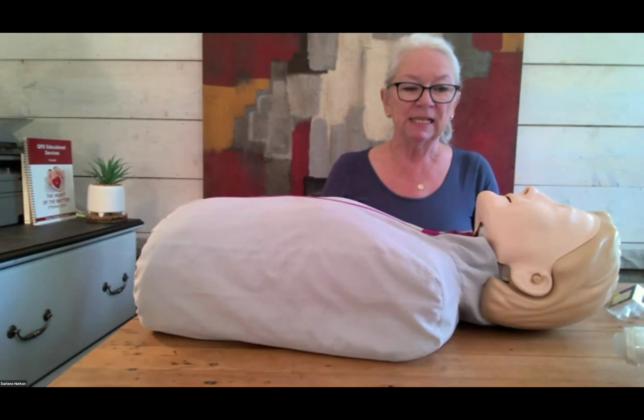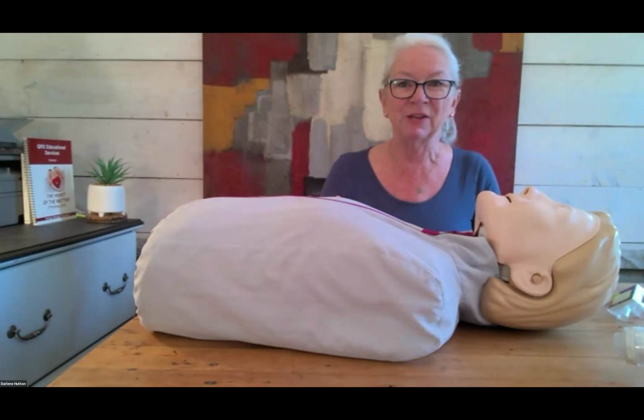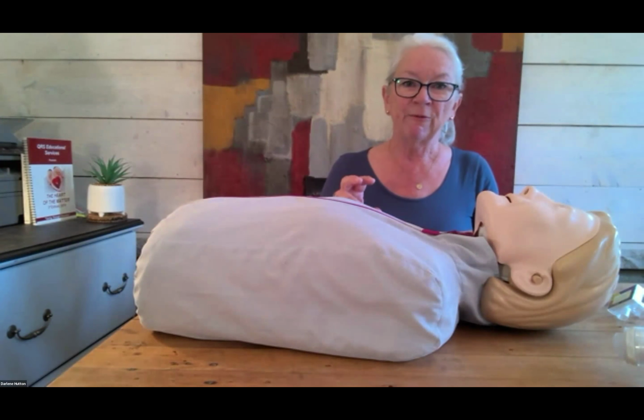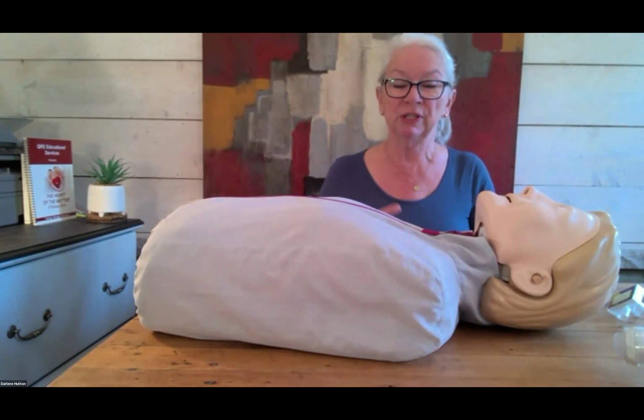If this patient is in a cardiac arrest and their heart is not beating and you are doing compressions, you should see a waveform number that is greater than 10. That indicates that you've got good compressions.